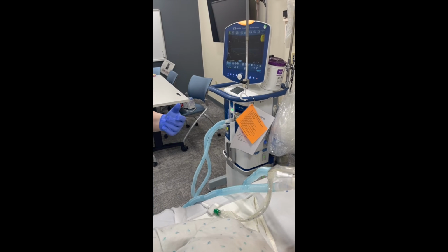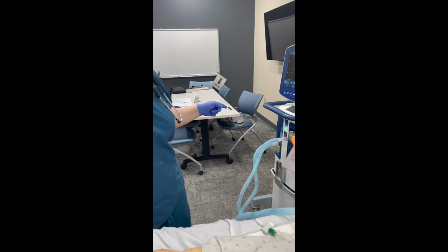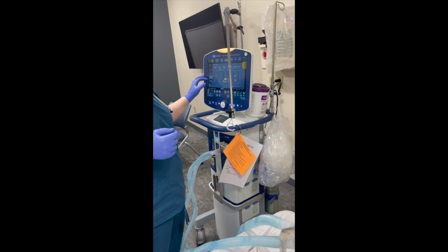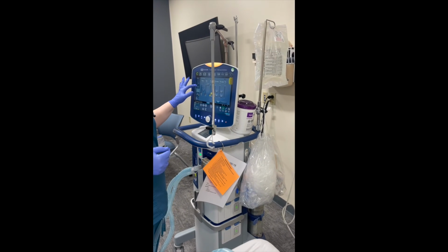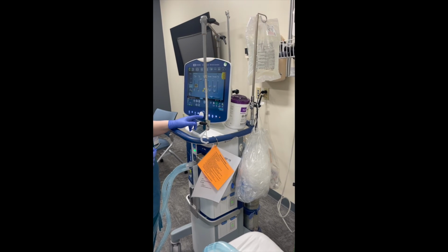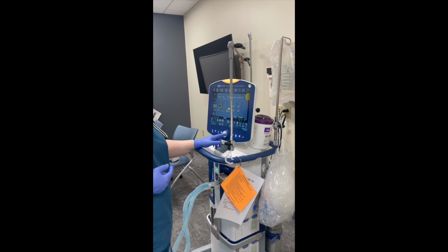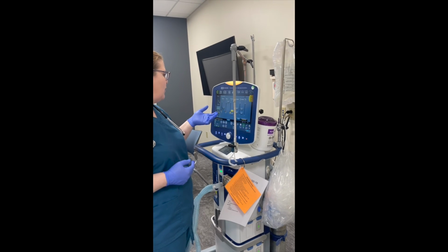And so then we're going to go ahead and set our alarms. Okay, so our alarms. So we're gonna set this to 35 because we want 10 above our peak. So the patient is currently at a peak of 25. So we'll set this to 35. I can't adjust the low.